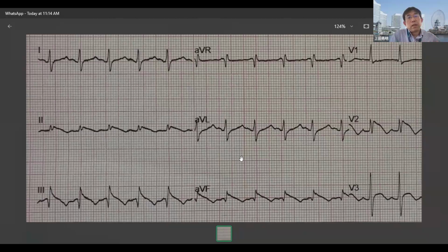What I feel from this ECG is that the heartbeat should be very prolonged and very weak. So maybe if you feel the liver, the liver size should be enlarged or something. Did you check the X-ray for anything abnormal? Are there any signs of congestion?